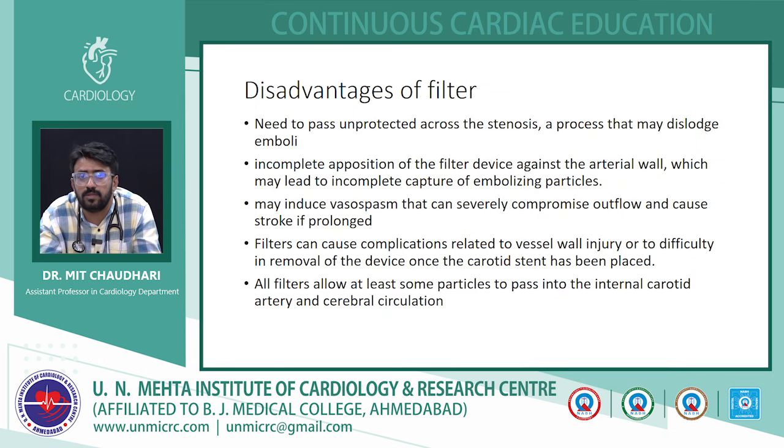So you have to use a device like an Export thrombectomy aspiration device to aspirate the blood that contains the embolized material prior to retrieving the filter, and then you place one more filter, and then you continue the rest of the procedure.